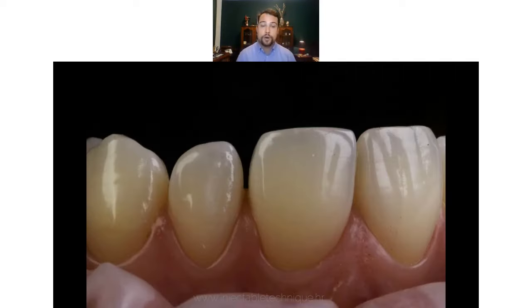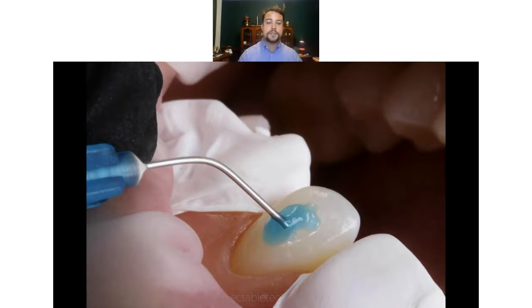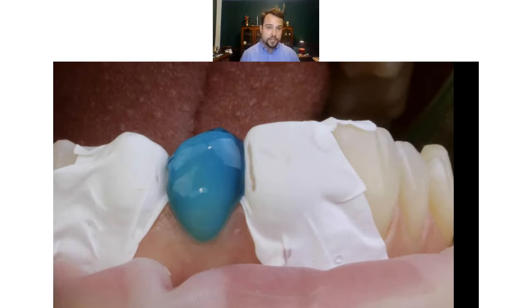This will be our model today, a single lateral, which was well documented with close-up photos. That's why I'm showing it to you, but you can also do it on multiple teeth. We're starting with the etching of the full dental surface that we plan to inject composite on. Here you have the superficial layer of unprepared enamel, where you have aprismatic enamel, and you want to open those prisms. So you can either sandblast or roughen the surface with some rough disc, or prolong the etching time to improve the adhesion of your future composite veneer.